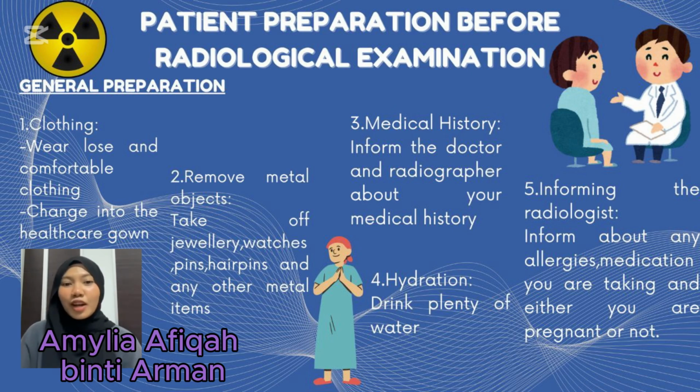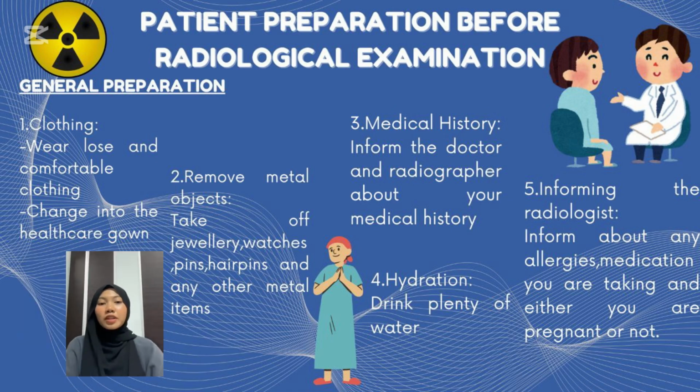So I'm here to talk about some patient preparation before radiological examination. I separate this topic into two types, which are general preparation and specific preparation. First, let's talk about general preparation. For general preparation, first is clothing. Patients need to wear loose and comfortable clothing. In many cases, the patient will be asked to change into a healthcare gown for accurate imaging and a better radiograph.